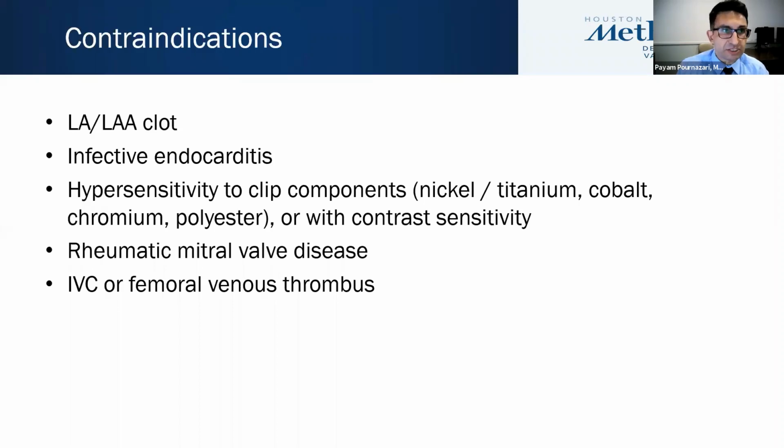So what are the contraindications to proceeding with a transcatheter edge-to-edge repair? Presence of LA or left atrial appendage clot, infective endocarditis, hypersensitivity to clip components such as nickel, titanium, cobalt, chromium, and polyester, or any sensitivity to contrast, rheumatic mitral valve disease, or thrombus in the IVC or femoral veins.